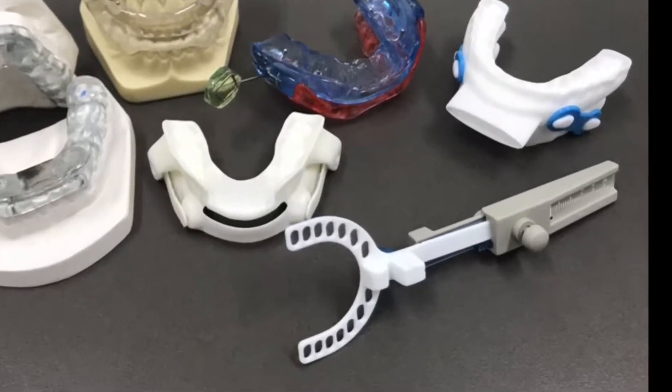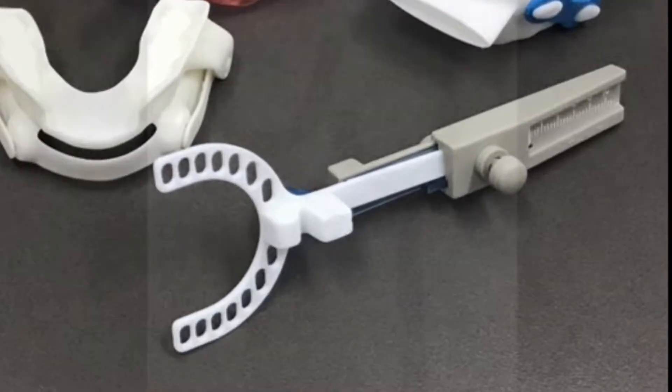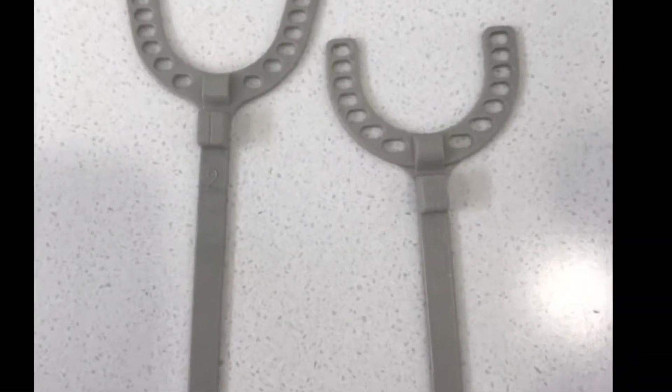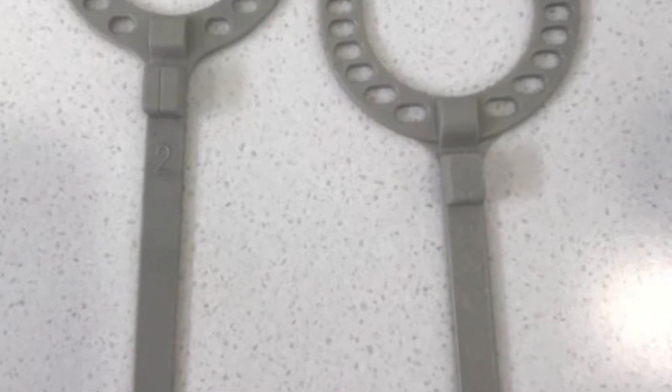Hi, so we're looking at how to take a bite registration with the George gauge. The George gauge has three components: the bite fork, lower incisor clamp, and body. The bite forks come in different sizes and the number on the bite forks corresponds with how thick they are.